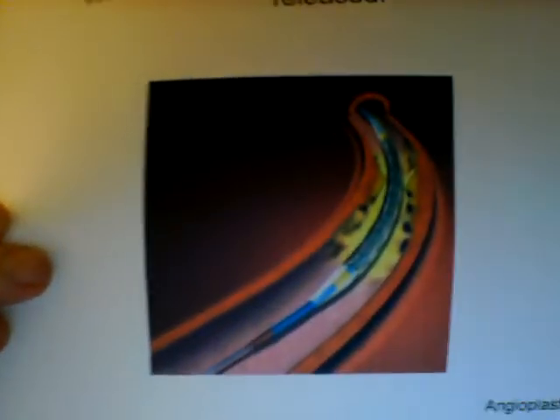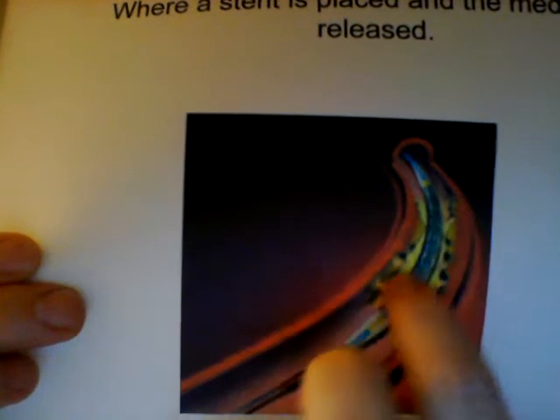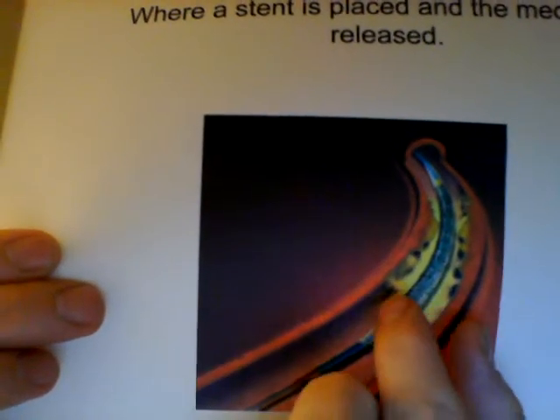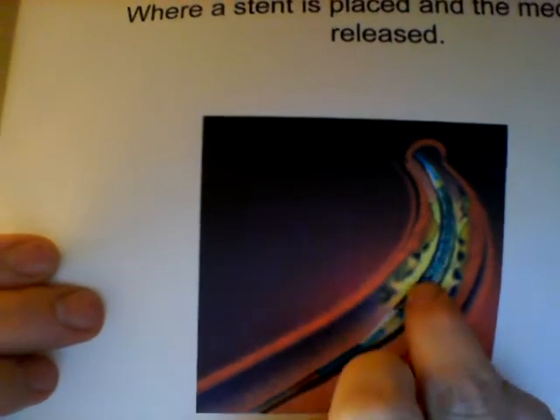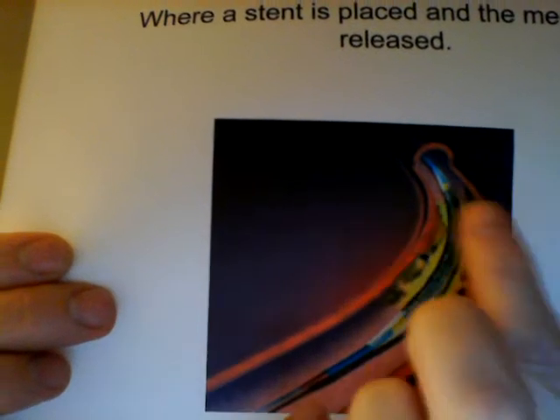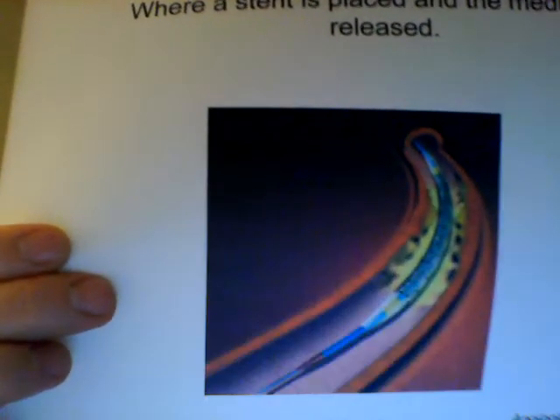Another representation of this from the angioplasty.org website is all this area right here. The yellow area is the plaque buildup. That's from the years of fried chicken and apple pie and not enough exercise. That's what happens. You get this plaque buildup in your arteries, and so the blood is not able to flow. The guide wire with the balloon and the stent is then run through the length of the lesion, which is what this part is called, and then the stent is expanded.